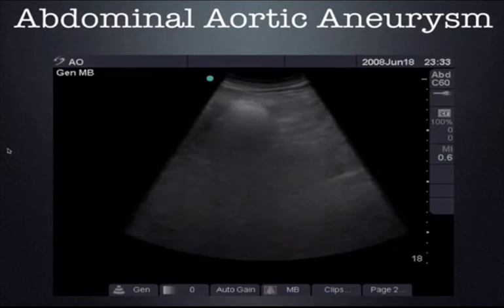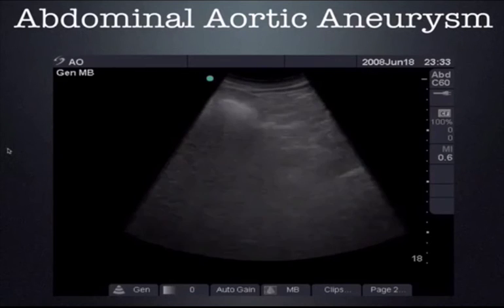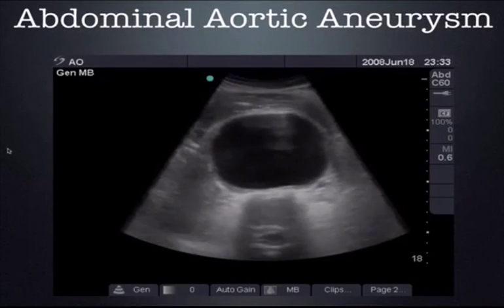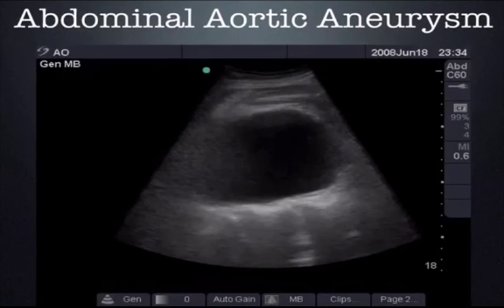You may look at a patient and say, oh, they're too large, or you may initially start your exam and say there's too much bowel gas, I'm never going to see anything. Well, keep looking anyway. Most likely, if there is one there, it'll reveal itself to you. But again, don't rule it out if you don't find the aorta.